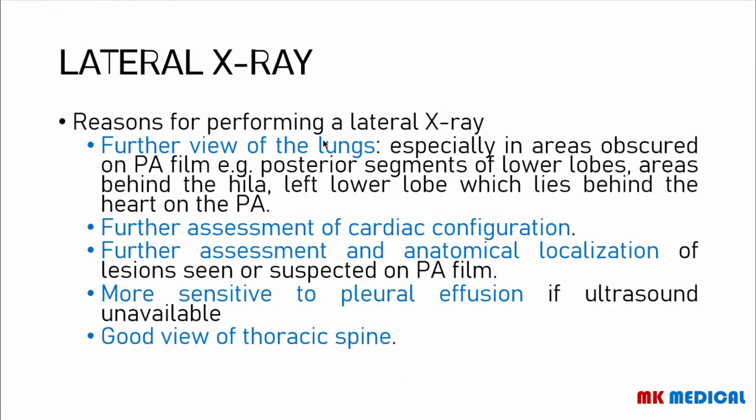So moving on to the lateral X-ray. We can order a lateral X-ray for many reasons. One of the reasons is if we want to further view the lungs. So if you want to get a 3D view of a certain lesion, like for example in the areas that are obscured, especially on the posterior anterior X-ray, like the posterior segments of the lower lobes, you can't really see them very well on the PA chest X-ray. Also the areas that are behind the hilar, you can't really see them very well. The left lower lobe, which lies behind the heart on the posterior anterior X-ray, you can't really see that. So you'd want to order a lateral X-ray.